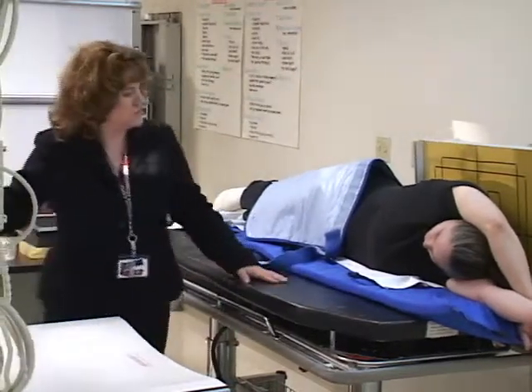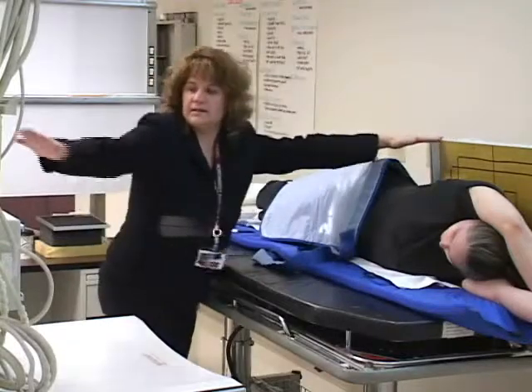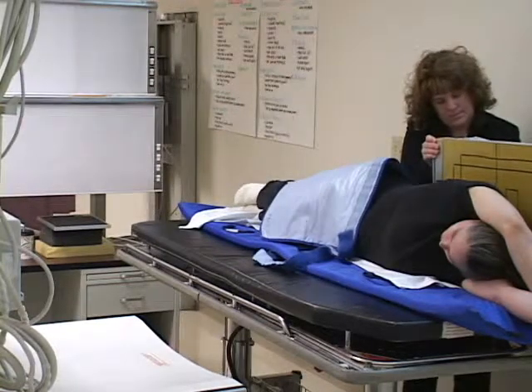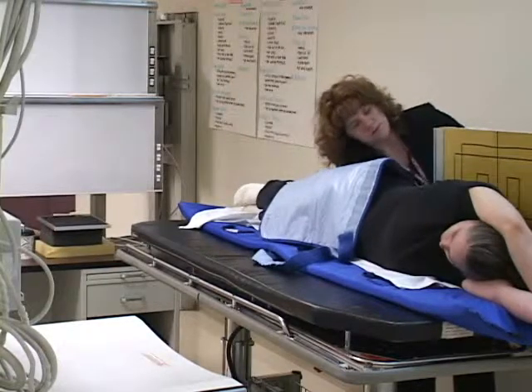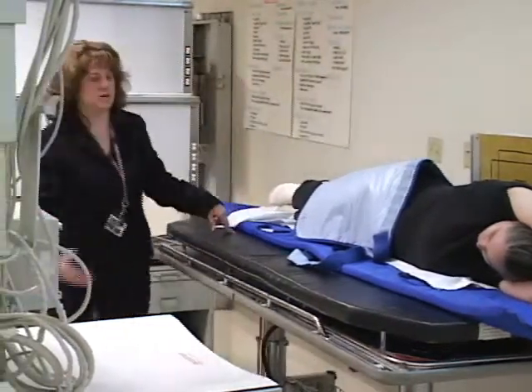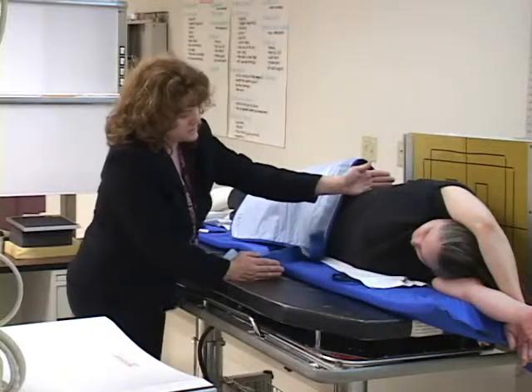I need to bring my tube head down here. Okay. Now I need to make sure that my wall bucky is lined up to my tube. So I'll come back around. Okay. I want to make sure that I'm getting the top of the apices of the chest and all the way down into the costophrenic angles.